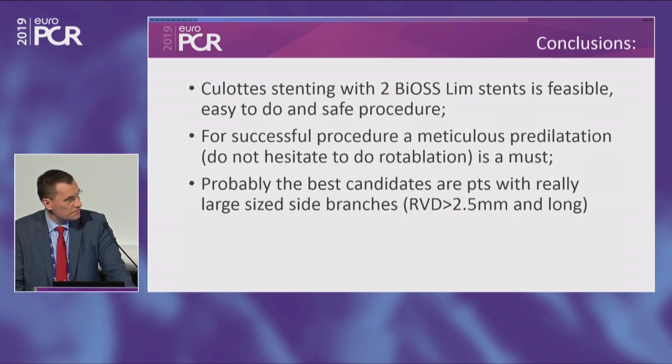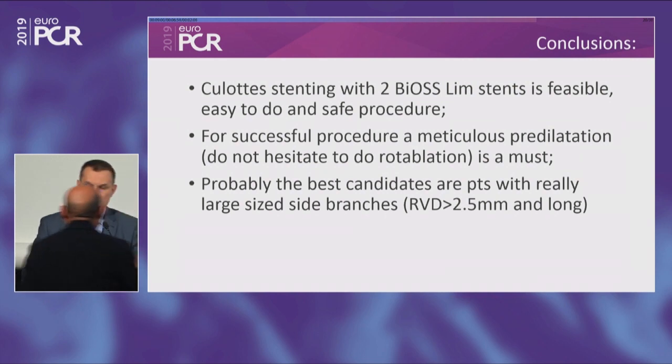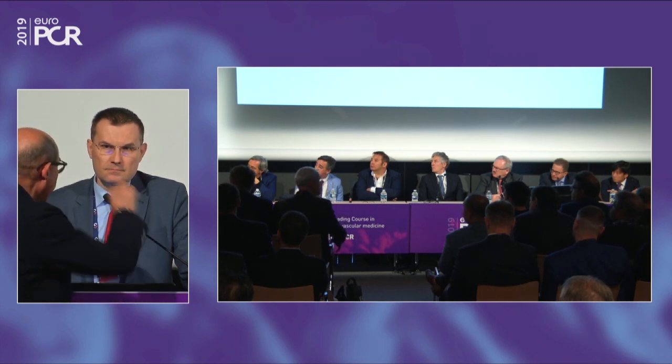Any questions from the audience? Don't be shy. If there is something that you did not understand, go to the microphone and voice your question. Is there any limitation of the angulation of the left main and the other vessels for the BiOSS stent?